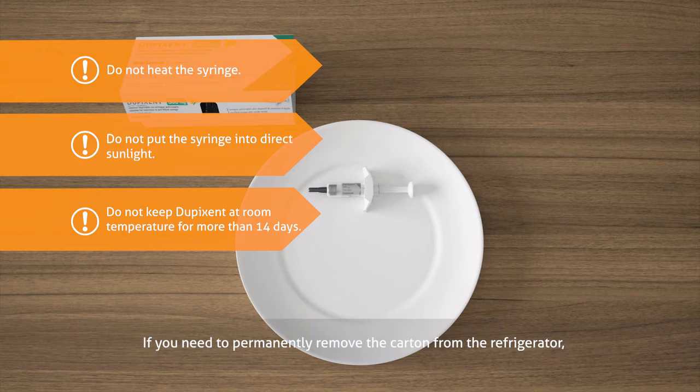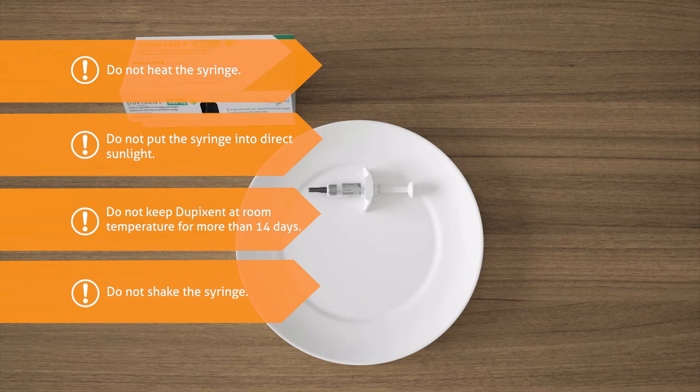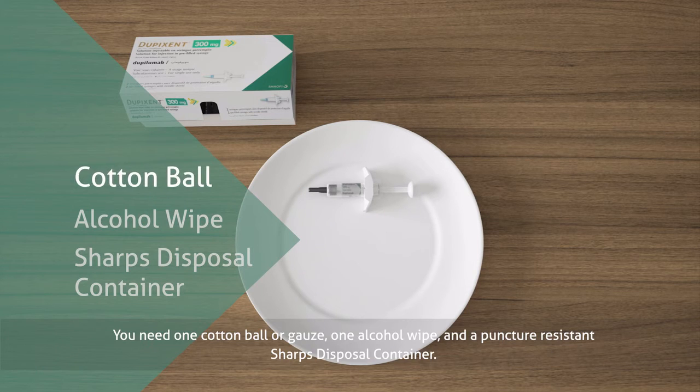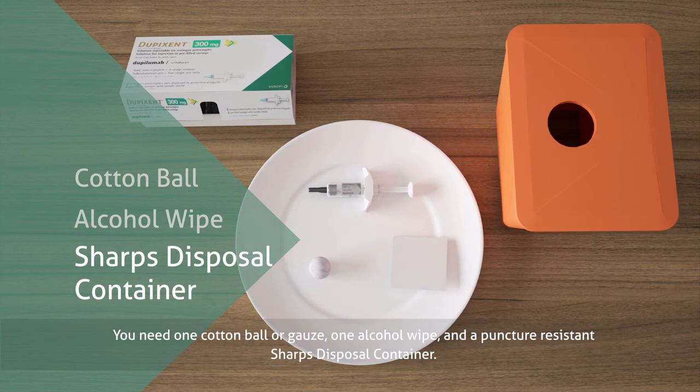If you need to permanently remove the carton from the refrigerator, write down the date of removal in the space provided on the outer carton and use Dupixent within 14 days. Do not shake the syringe. While you wait, gather the additional materials necessary to self-inject: one cotton ball or gauze, one alcohol wipe, and a puncture-resistant sharps disposal container.